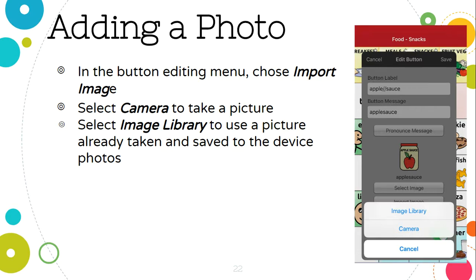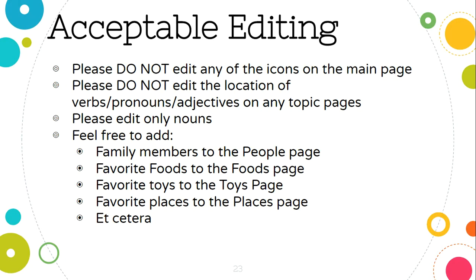So again, I talked about this a little bit in the video, but that's acceptable editing. So please do not edit any of the icons on the main page.